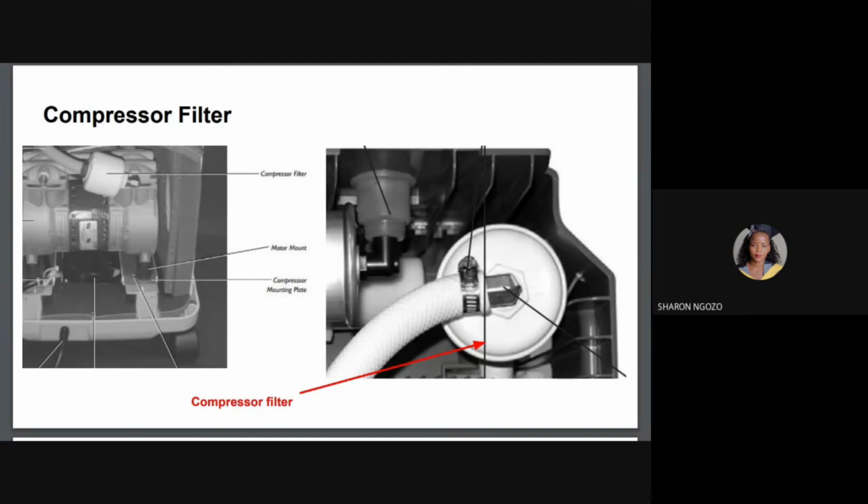And if your concentrator doesn't have some of these filters, then you really need to be careful, because when you're using the concentrator on a patient, you need to have these filters for the well-being of the patient, and for the better performance of your concentrator. So reaching this far, this is the end of the special topic. Thank you.